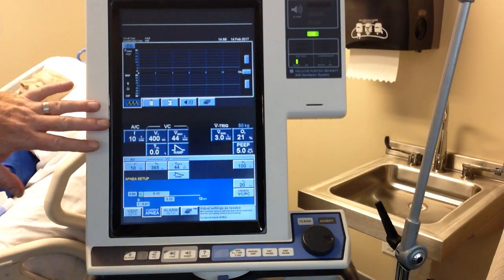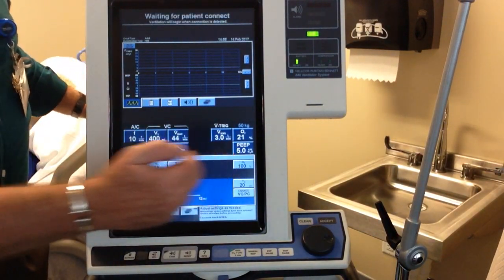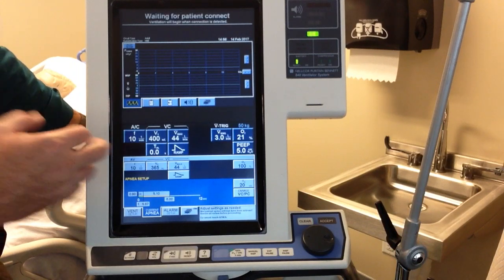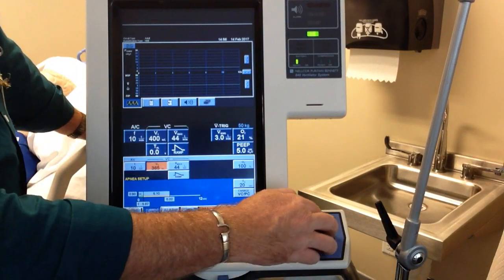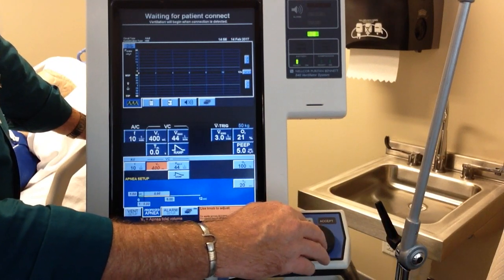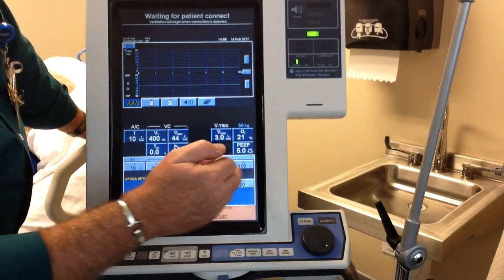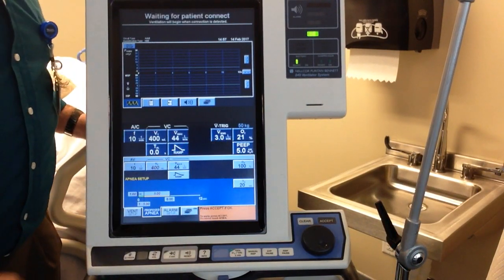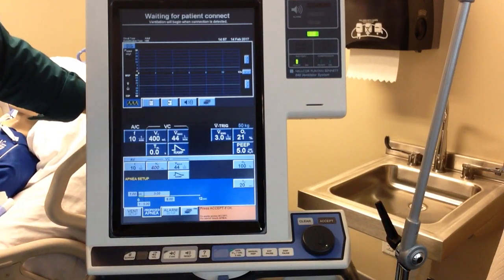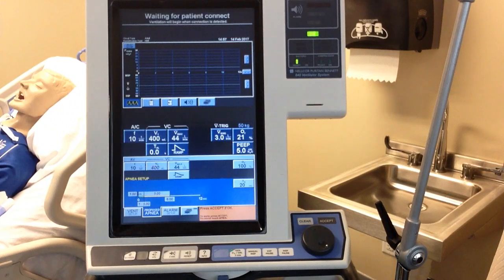What it does, these are my ventilator settings here in this section, and these are my apnea settings. So if my patient for some reason stops breathing for some time, we want our apnea settings to provide full support. Since our settings are on full support already, we will mimic those settings. And if they're going apneic, something's going wrong, typically we'll leave it on 100%. Unless you're doing neonates, but that is fall semester. So it's waiting for a connect.